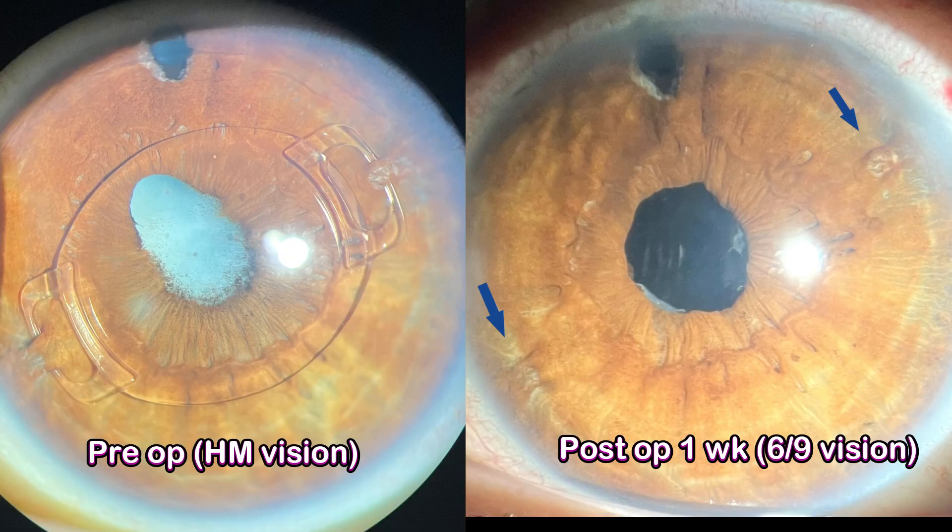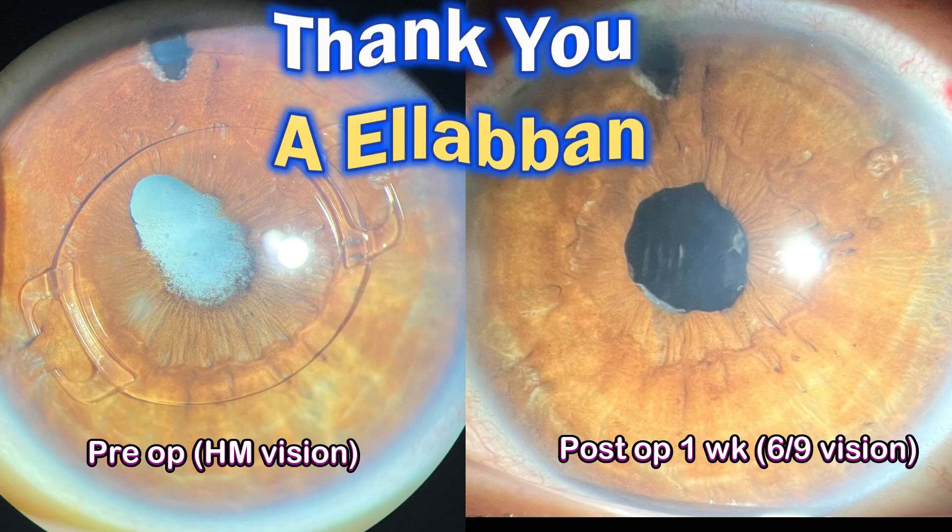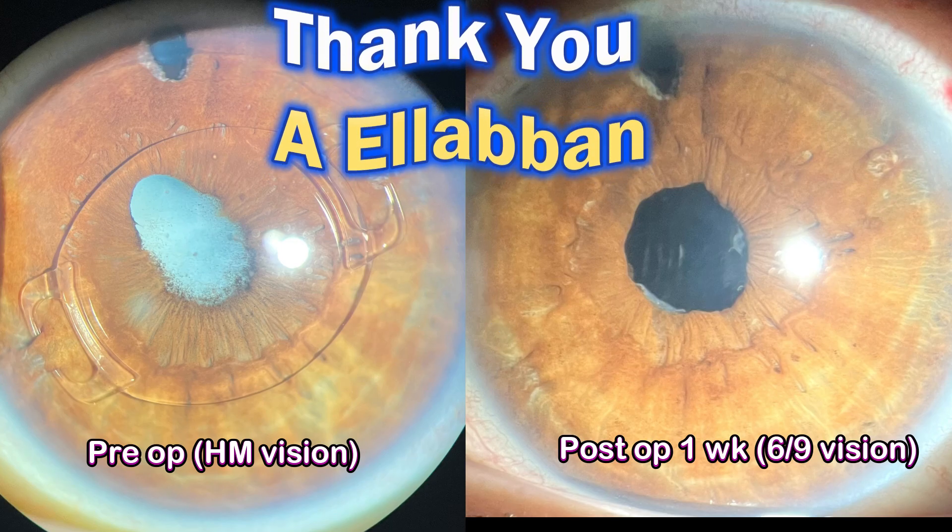This is the one-week post-op picture. The patient has 6/9 vision with a good visual outcome and is very pleased with the surgery. Thank you very much for watching.